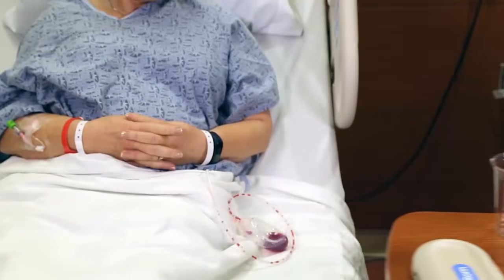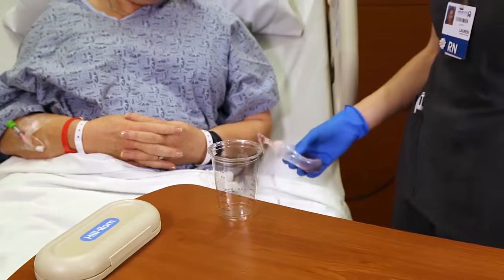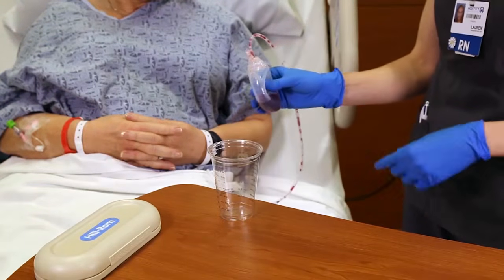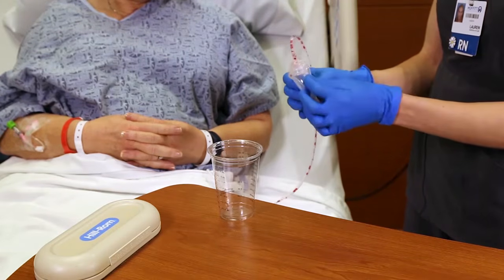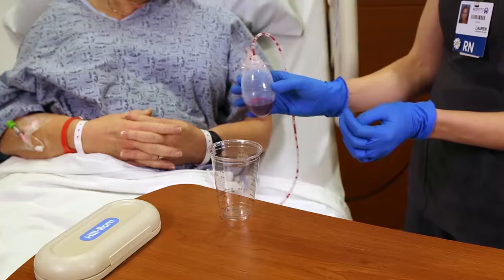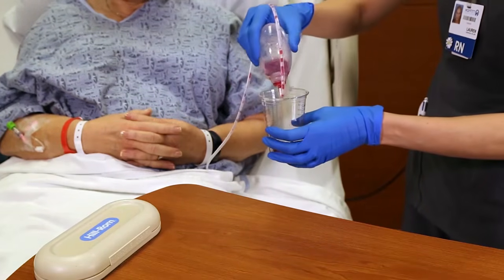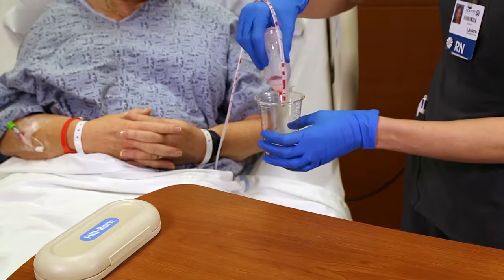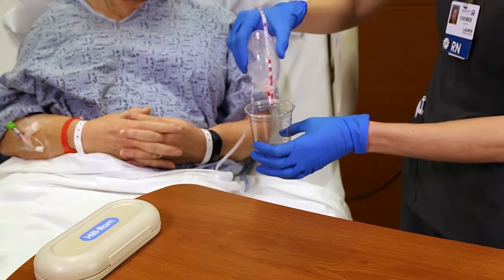Your next step is to empty the drain. You'll need to empty your drain at least 3 times a day or more if needed. Hold your bulb securely in your hands. Take the plug off the top of the bulb and let it expand. You'll dump the JP bulb over the measuring cup and gently squeeze the fluid out. Some fluid may still be left in the bulb, and that's okay.